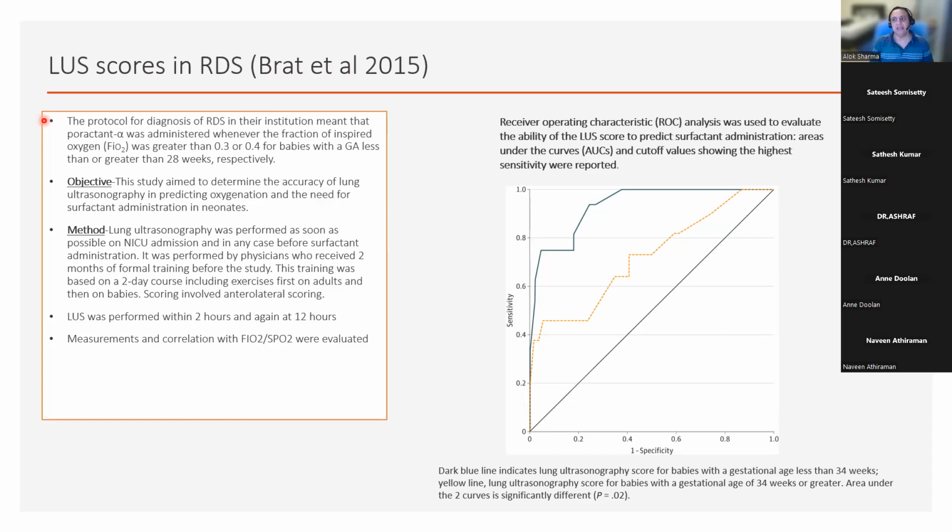but more importantly, your differentials, meconium, and the risk of TTN are much higher, because retained lung fluid becomes part of the differential. And we know these conditions can actually overlap with RDS. So that's why, over 34 weeks, you have wider differentials that will bring the sensitivity and specificity of the lung ultrasound score down.